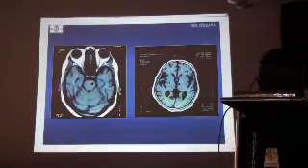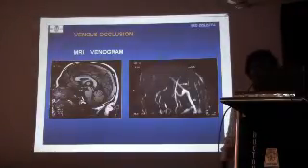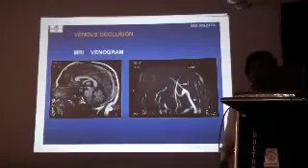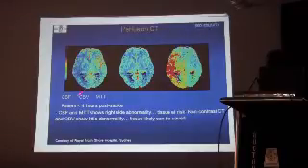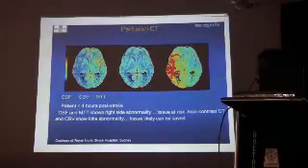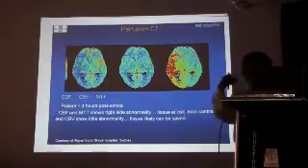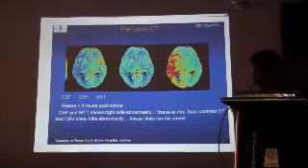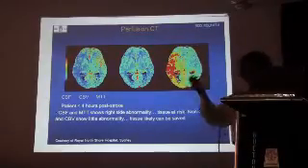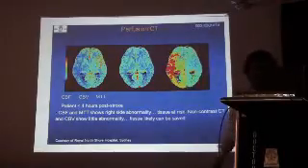Cold infarcts. Venous, I'll come to the issue of venous infarct. That is one of the complicated issues we deal with. Now, perfusion CT is another important thing. We measure cerebral blood flow, cerebral blood volume, and mean transit time. Those who are studying for a PhD, this is useful. You must face these questions with the examiners who are coming from outside. But they do, in fact, perfusion.